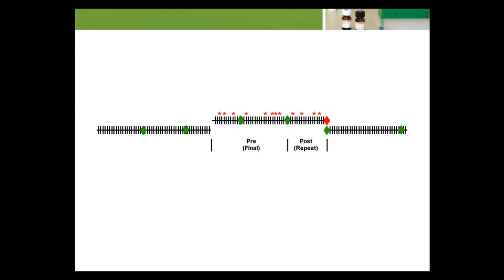Patient results produced after the last accepted QC need to be evaluated, possibly re-examined, and corrected if necessary. These are also the results addressed in CLIA 493.1282(b)(2). Limiting the number of correctable unreliable patient results is critical to recovery.